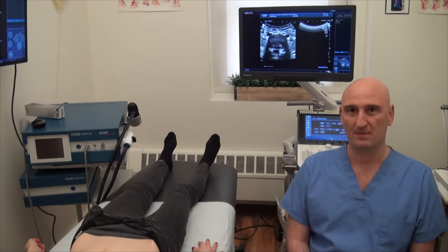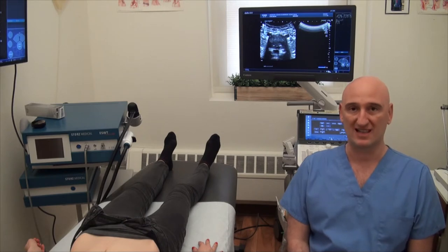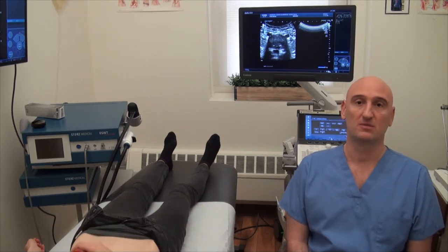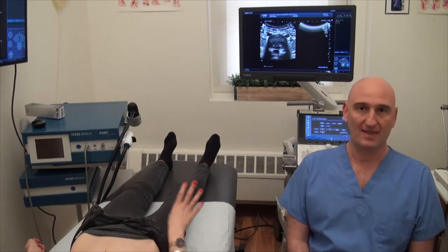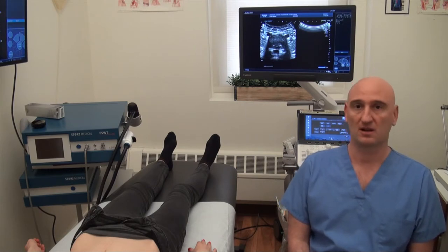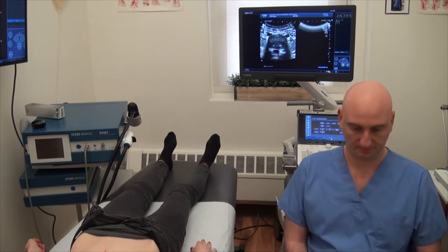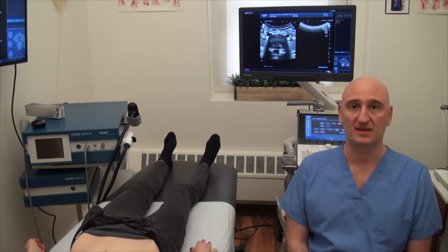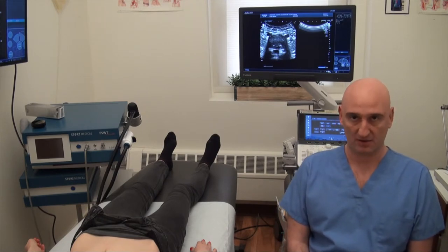About 8 years ago, I learned a technique with ultrasonography that is very comparable to magnetic resonance imaging. It's a screening technique for herniated discs — whether bulge, herniated, or any variation of those slipped discs — that can be seen on diagnostic ultrasonography.